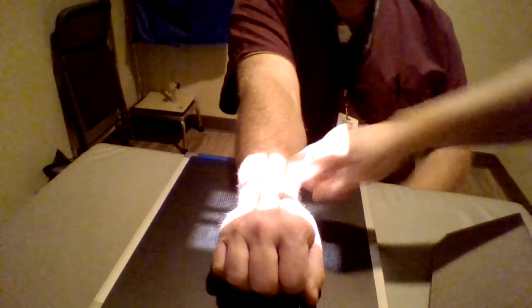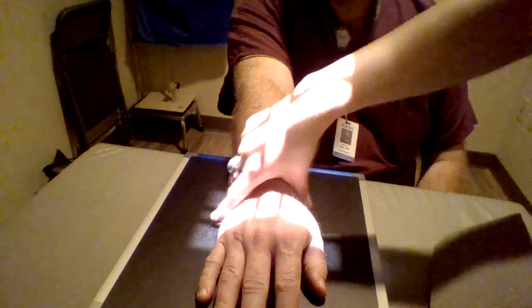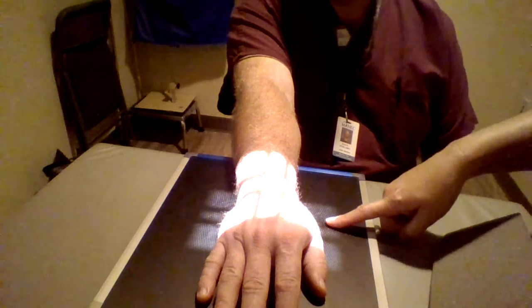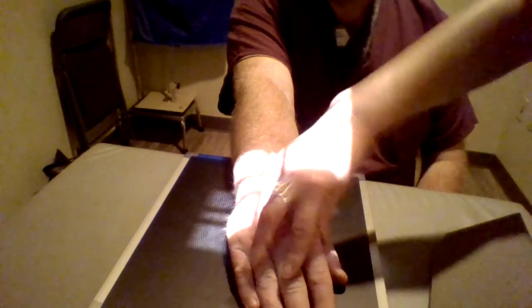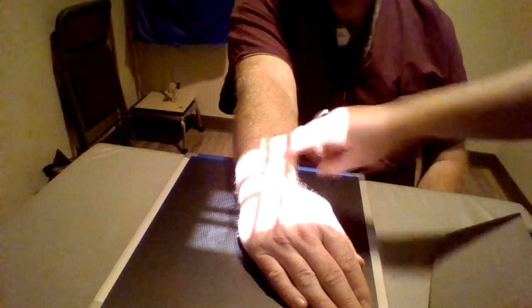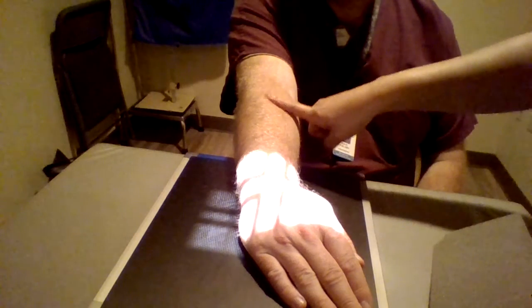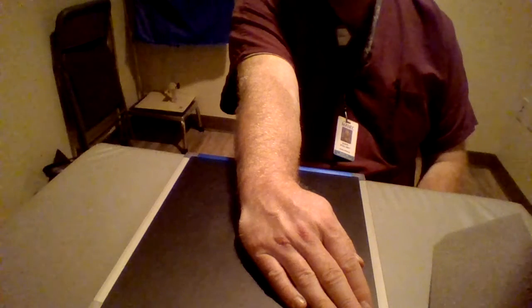So you're going to have the patient put their wrist back up onto the cassette for PA projection, palm down, wrist and hand aligned at the center axis portion of the IR being exposed. So without moving the forearm, you're going to gently invert the hand medially toward the thumb side as far as the patient can tolerate without lifting or obliquing the distal forearm. You're going to center the ray perpendicular to the IR, directed at the mid-carpal area, minimum SID of 40 inches.